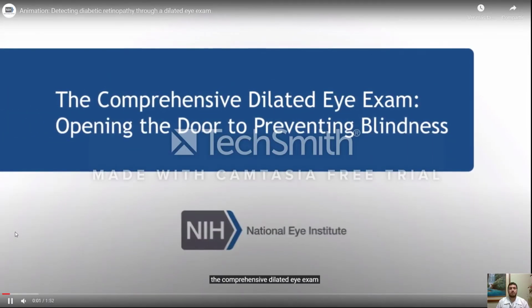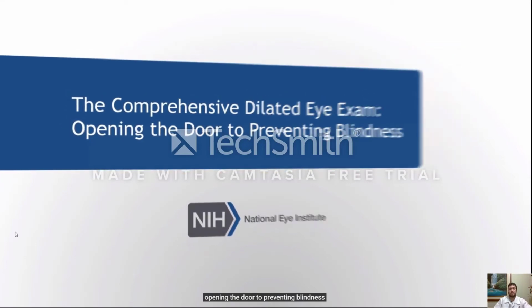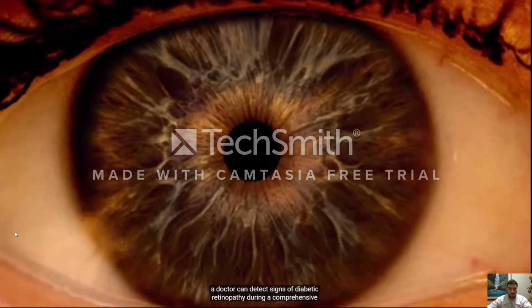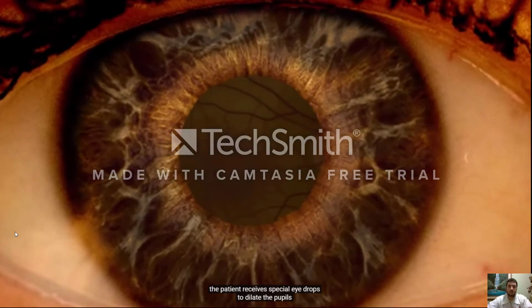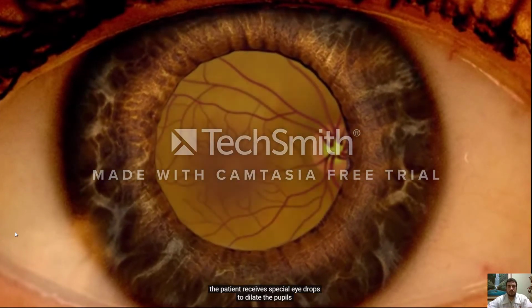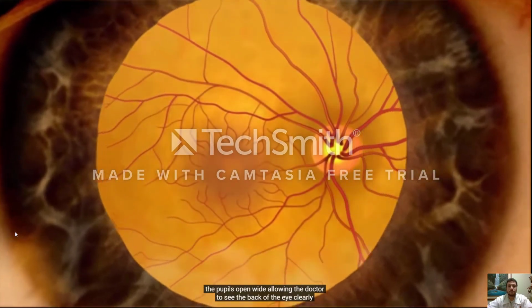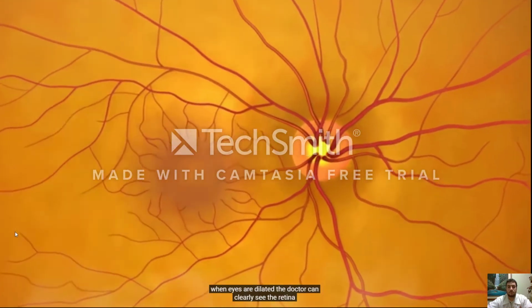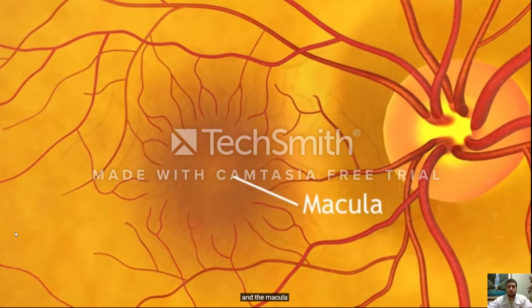The comprehensive dilated eye exam, opening the door to preventing blindness. A doctor can detect signs of diabetic retinopathy during a comprehensive dilated eye exam. The patient receives special eye drops that dilate the pupils. The pupils open wide, allowing the doctor to see the back of the eye clearly. When eyes are dilated, the doctor can clearly see the retina, optic nerve, and the macula.